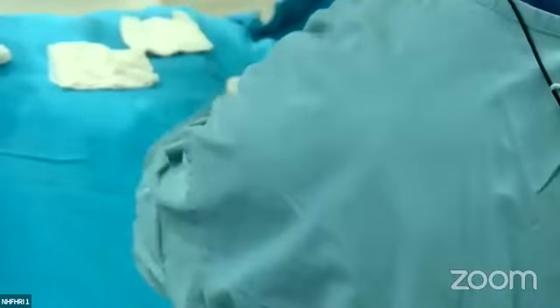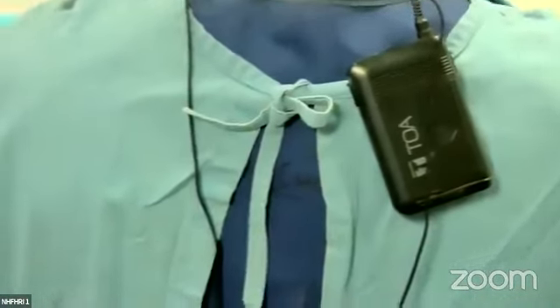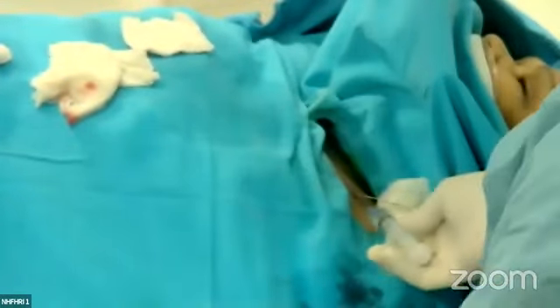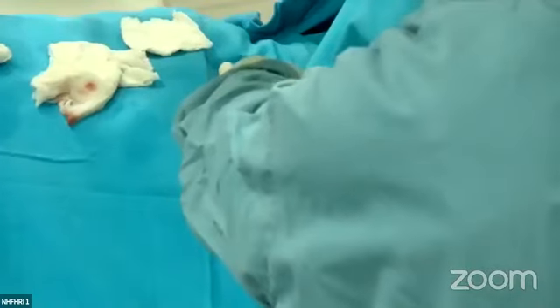Then I used to do the puncture. I put the index finger on the suprasternal notch, and targeting the suprasternal notch, I puncture from 1 to 2 centimeters below the clavicle.